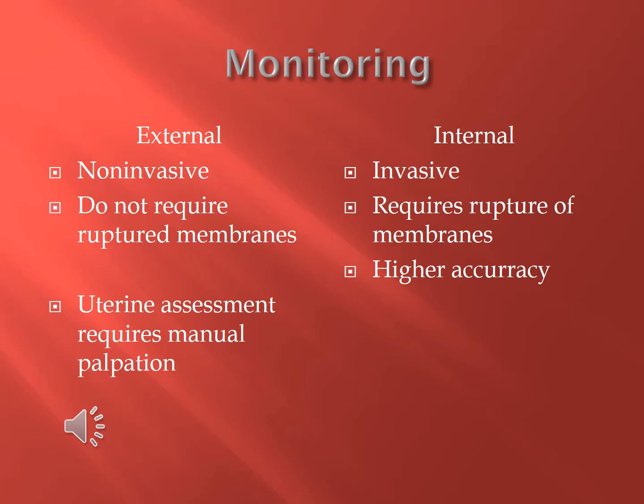The placement of an internal monitor is an invasive procedure and it requires that the membranes be ruptured. Internal monitoring may be contraindicated in certain scenarios. Internal uterine monitoring provides more accurate uterine activity information.